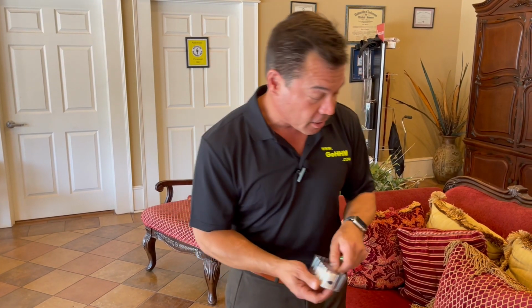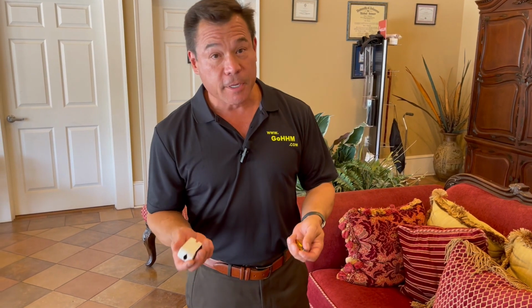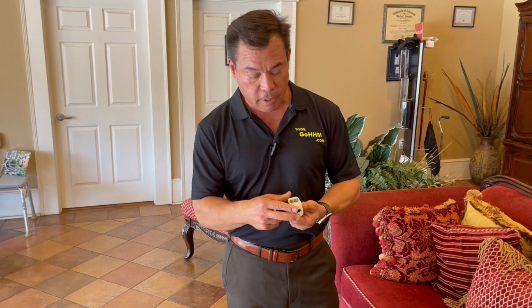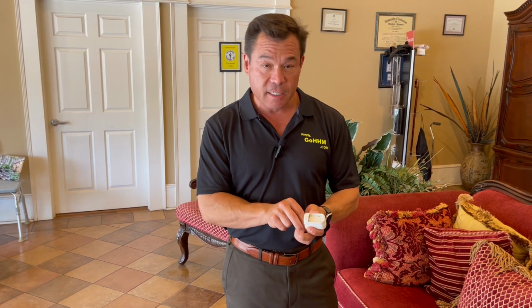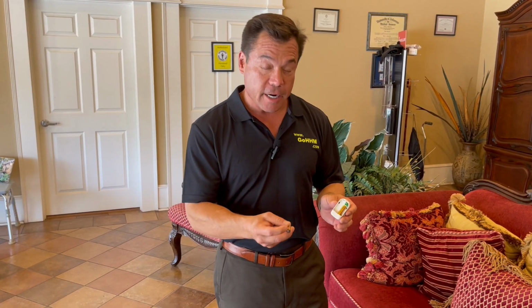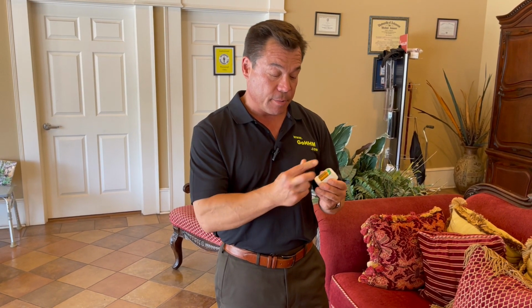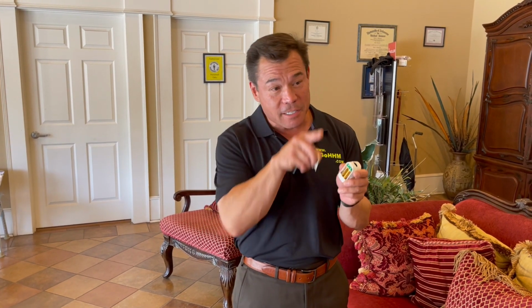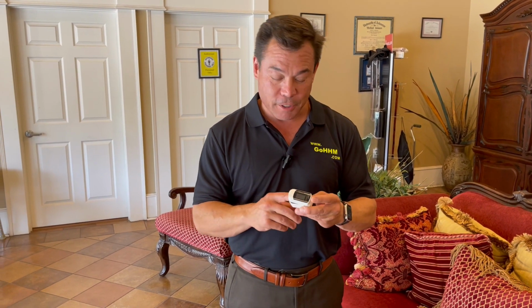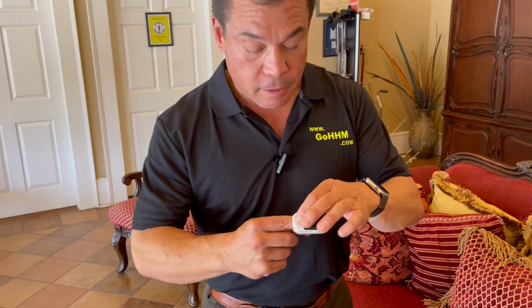And 2 AAA batteries. The thing I like about this particular SureLife model of pulse oximeter is a couple things. Number one, it takes the AAA batteries, but the nice thing is they've done this so that both the batteries go in the same direction, negative on the bottom and positive on the top. The reason that's nice is it just makes it easy. You don't have to worry about looking at tiny little print that shows the battery pointing this way or that way. You just put them both in the same direction. Close that up.